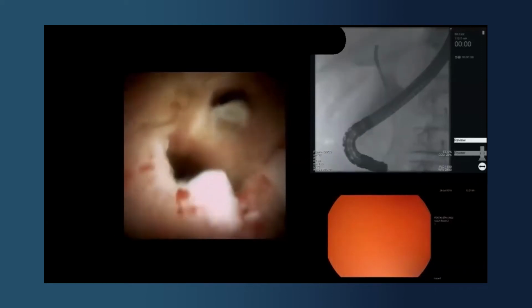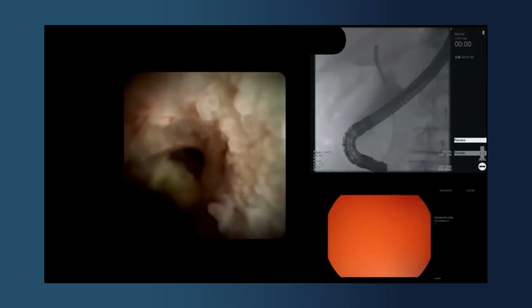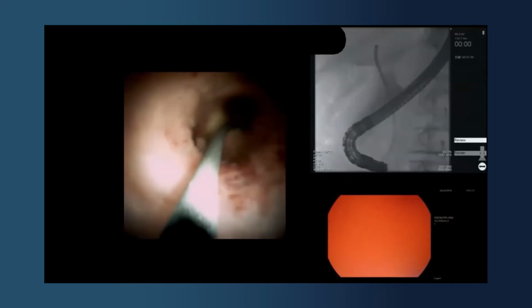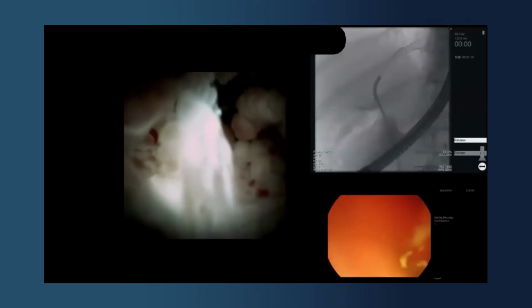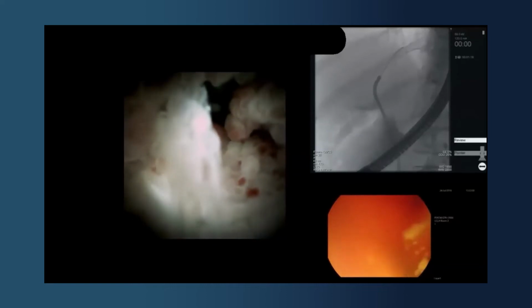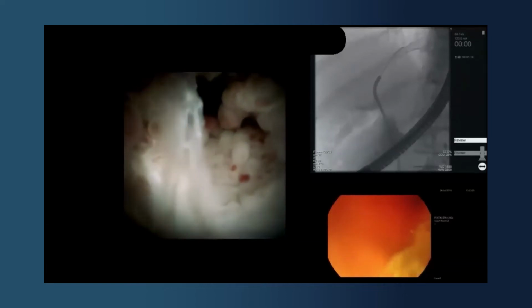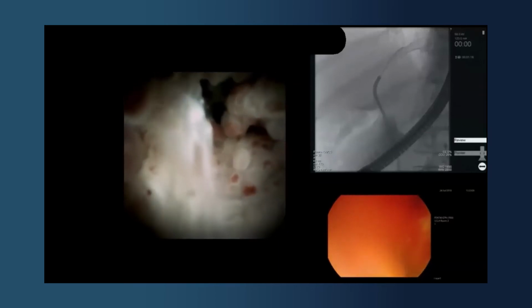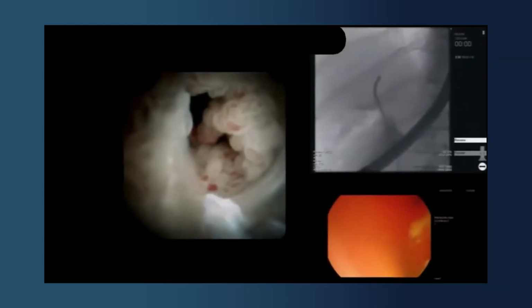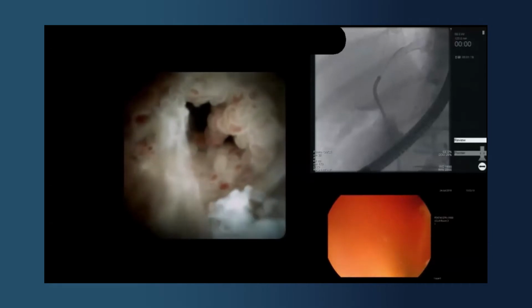But the question for today is, what visual diagnosis would we give to these abnormalities, including this area in the left hepatic duct? Is this PSC-related inflammation? Is it dysplasia, or is it cancer? The answer on histology was that this was high-grade dysplasia.